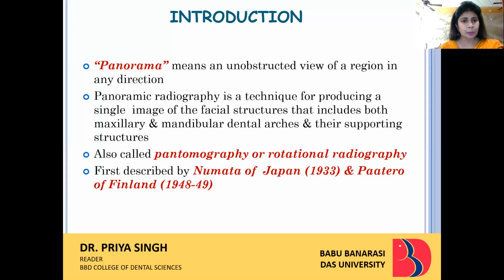Before principles, it's very important to understand from where this particular panoramic has originated, from where it has got the name panoramic itself. Panoramic is a wide view or an unobstructed view of a region in any direction. Panoramic radiography is a technique for producing a single image of the facial structure that includes both maxillary and mandibular dental arches and their supporting structure.